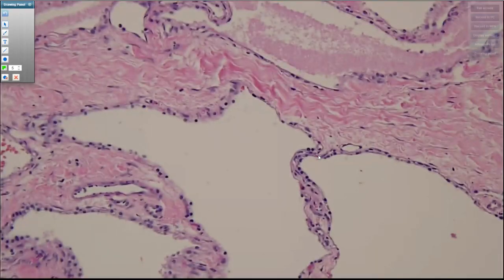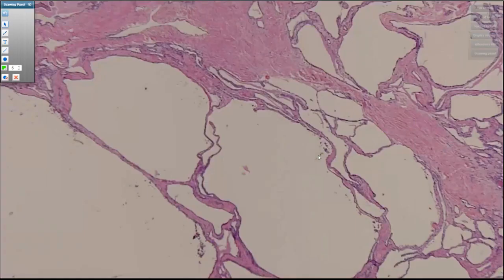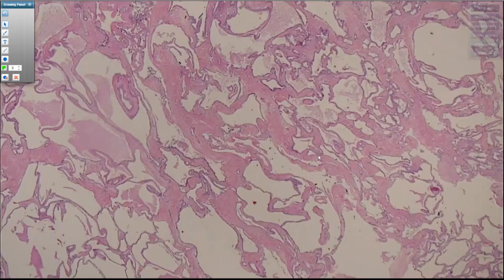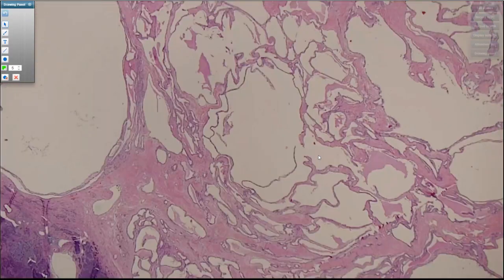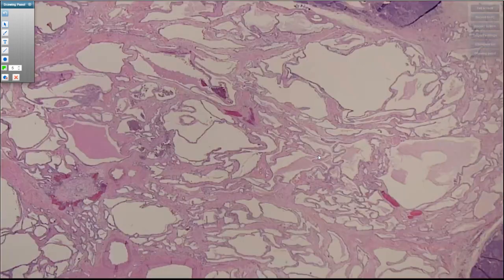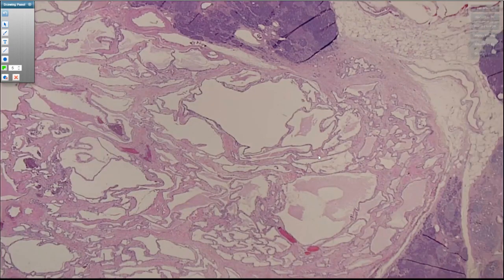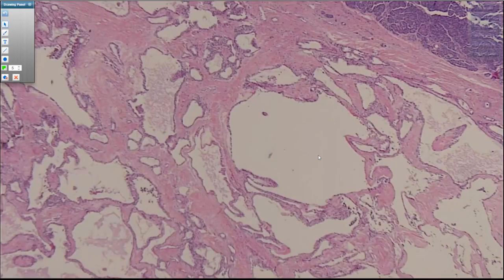So we'll enjoy some more features of that. They often have a dense fibrous banding to them, which often coalesces in the middle. Sometimes you'll get, both grossly and histologically, a nice central scar, which correlates to what they saw on radiology for this particular patient. Serous cystadenomas are a little bit more common in women. They're almost invariably benign. There are very, very rare instances of them metastasizing.